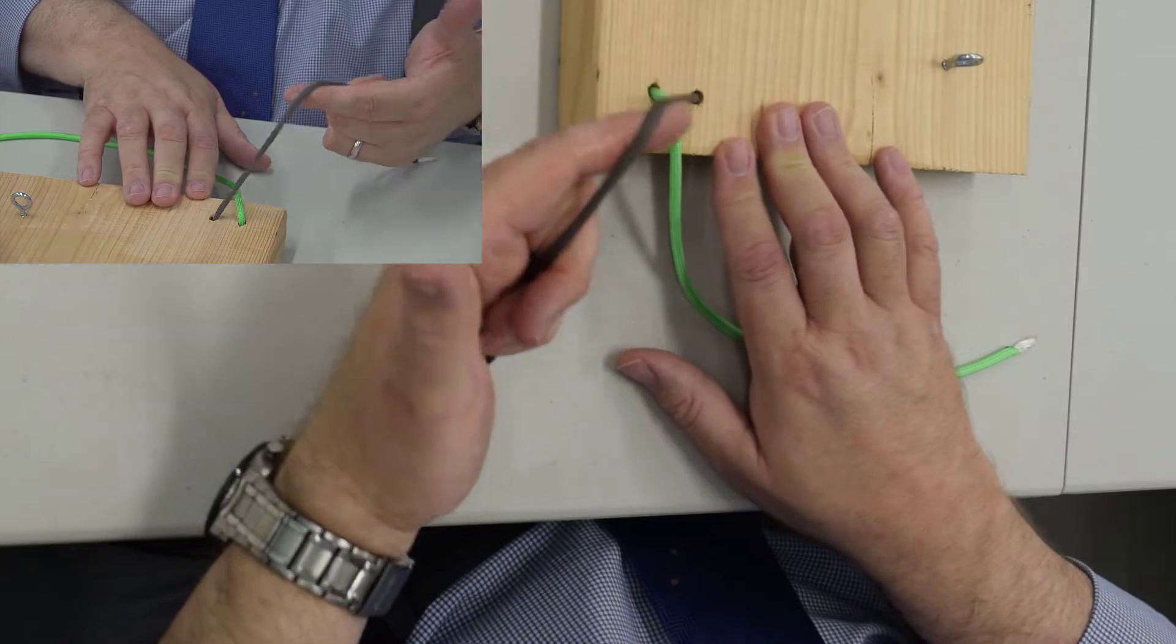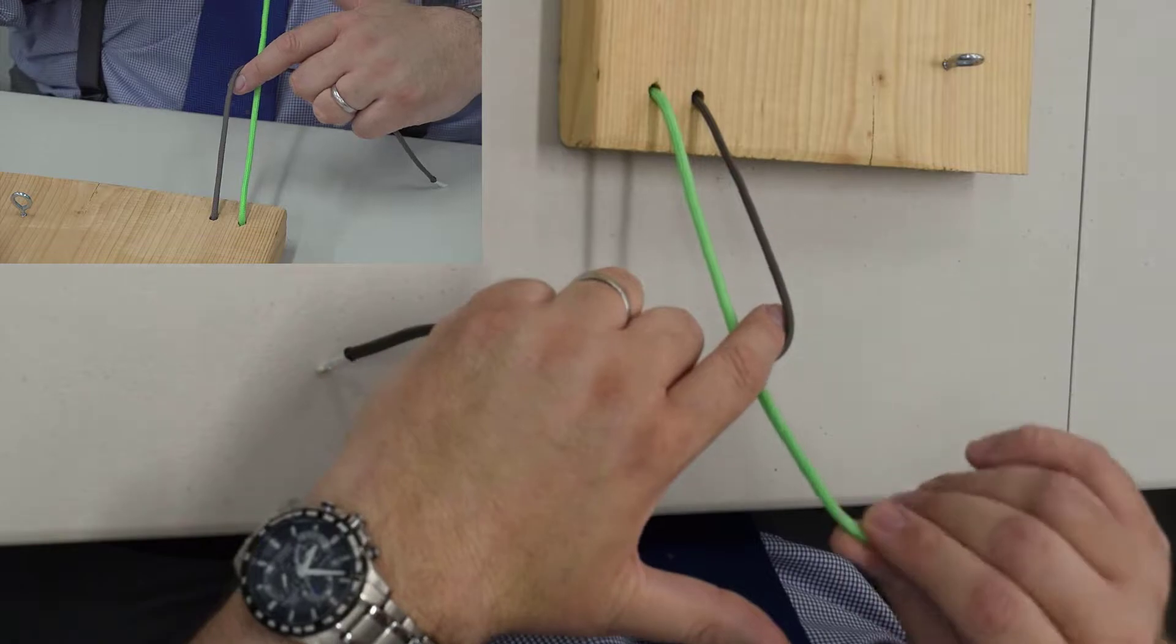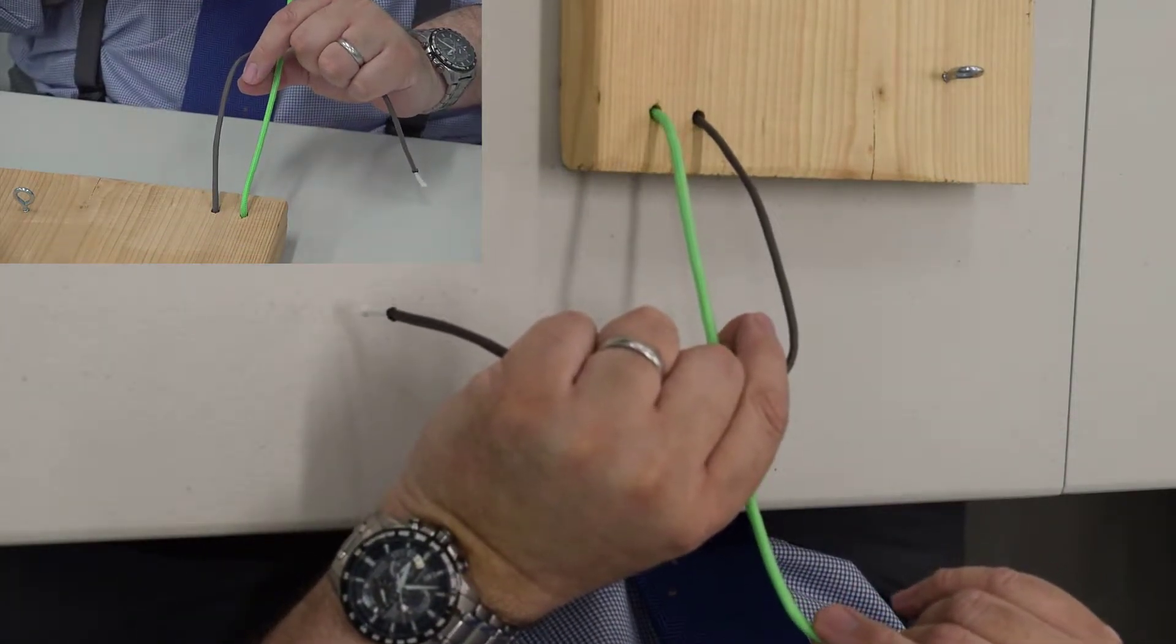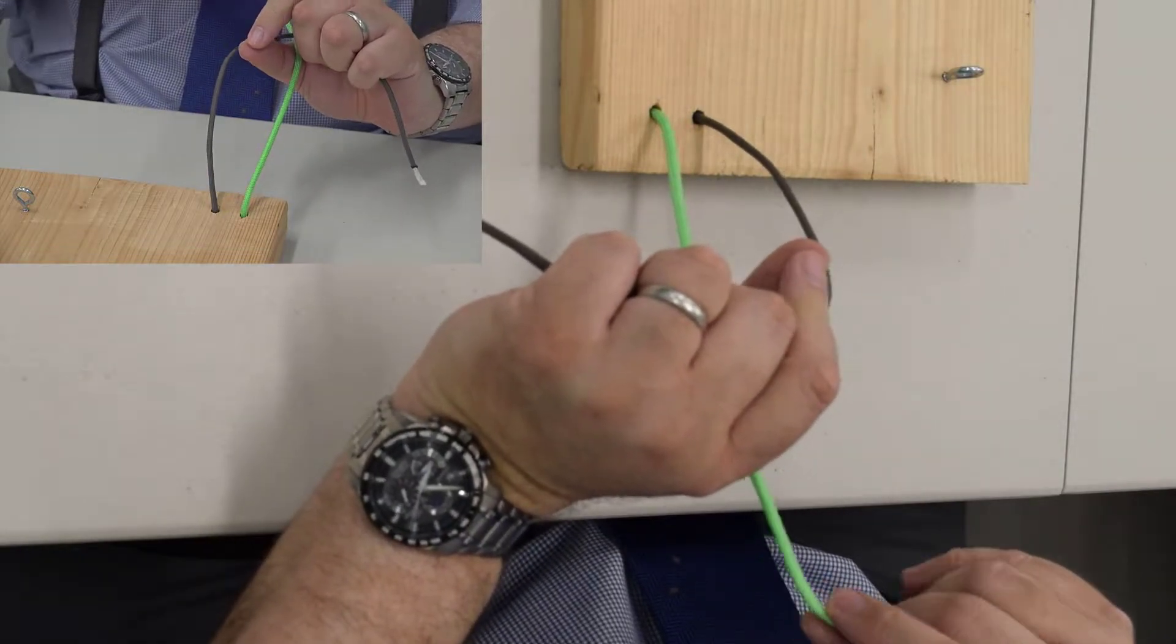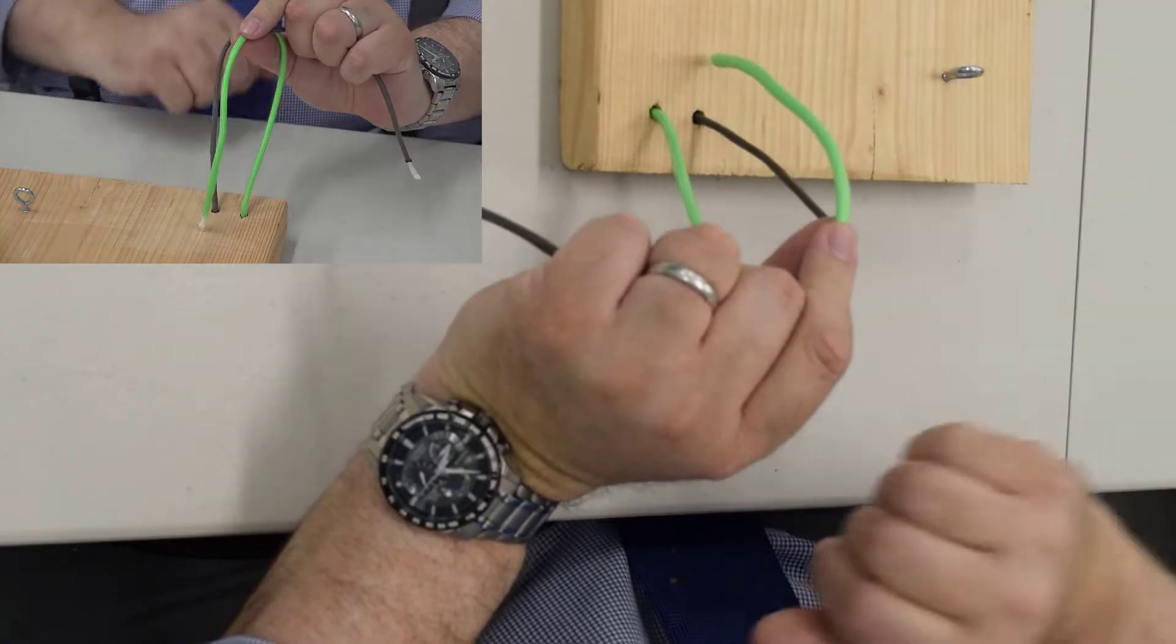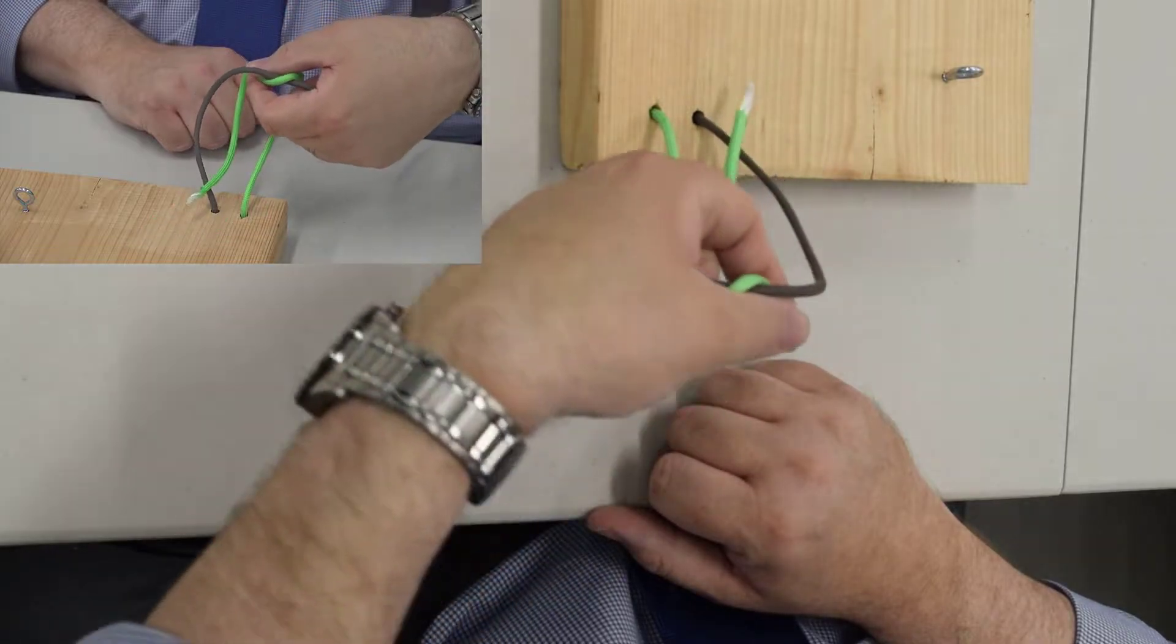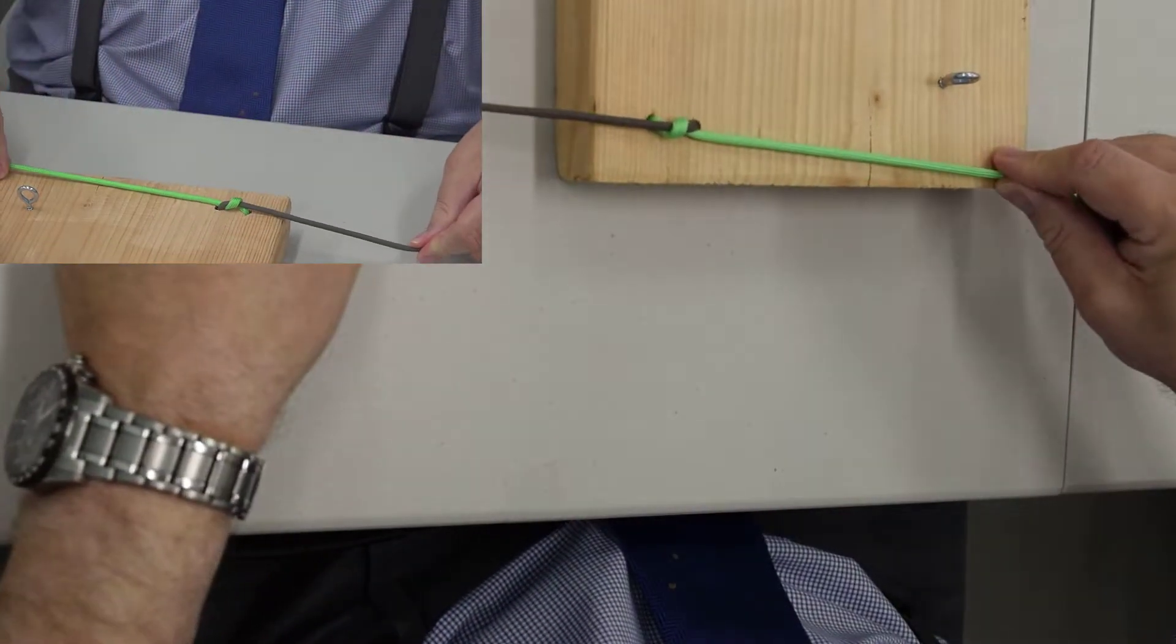So the first stitch, make the gun, cross it, pinch my thumb and my index finger, rotate it up, hand the green stitch to myself through my thumb and index finger, and then rotate my wrist down, grab the suture, comes down nice and pretty.